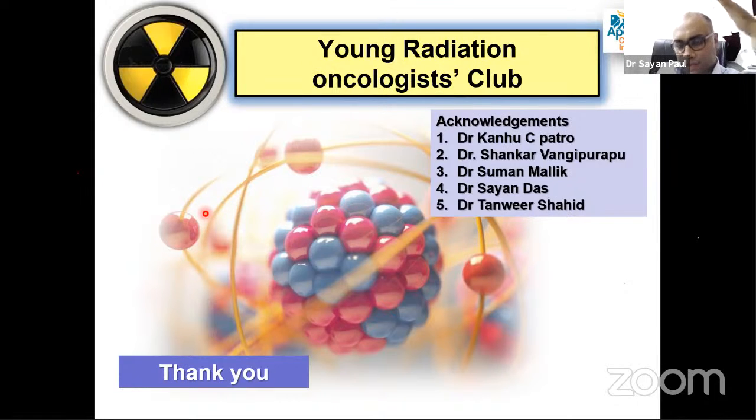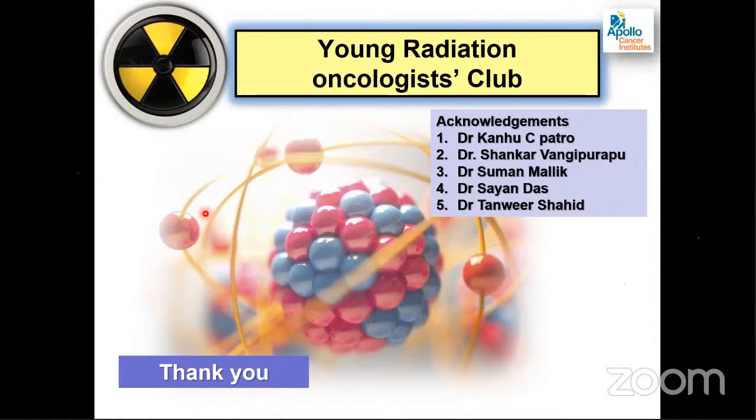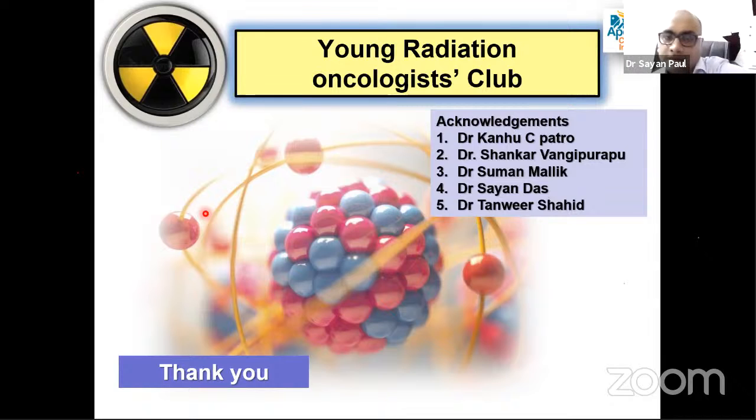Slow CT is in a particular couch position, the acquisition time is more. So the couch, if it is helical, moves very slowly. So what happens is that during acquisition, the tumor moves. So it detects the movements of the tumor. But in slow CT, it can only help you or guide you in generating the PTV. Only on slow CT, you cannot generate it. The images are blurred and it is not an exact representation of the tumor movement. Very true, because target delineation is very difficult on a slow CT because the edges are so blurry.